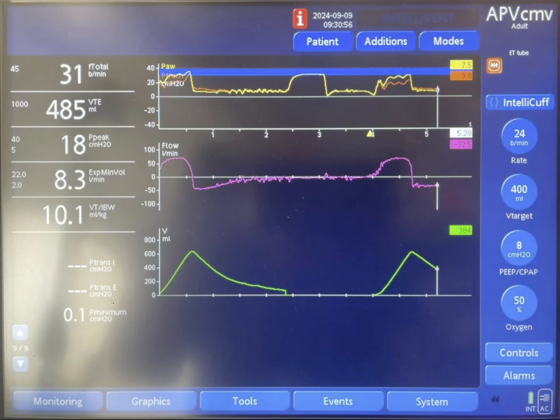Hey guys, I got this interesting case a few weeks ago. I took a screenshot and a video, and I thought I would share it with you. I may have an explanation for this, but feel free to share your thoughts about it.